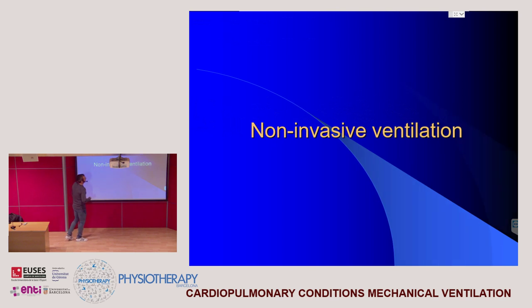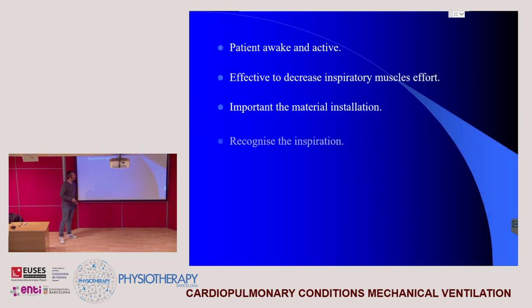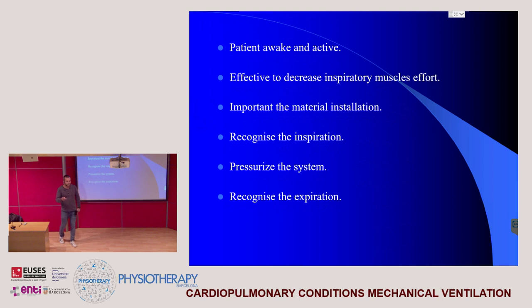Why is invasive or non-invasive ventilation so important? In terms of spontaneous ventilation, we have the same criteria. That means that the patient has to be awake and active. Obviously, the patient has to perform their own respiratory efforts, but the ventilation unit will help the inspiratory muscles.